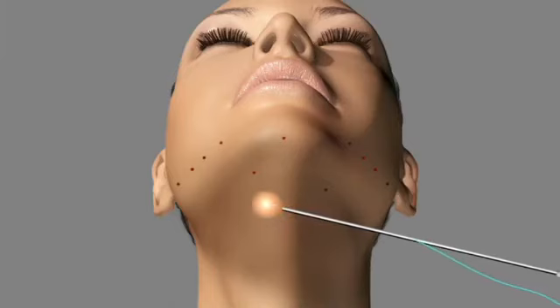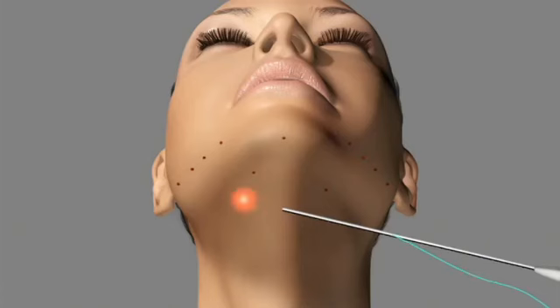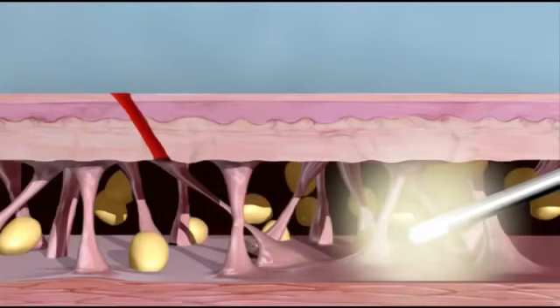which exited through the puncture wound where the neck-defining suture was placed. The midline, most posterior neck-defining suture puncture site is used as the insertion site for the suture rod. The suture rod is then passed in the subcutaneous plane. If it passes too deeply, a dull red light will be seen transilluminating. This means the rod needs to be backed up and re-advanced more superficially.